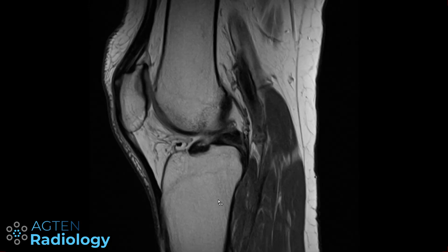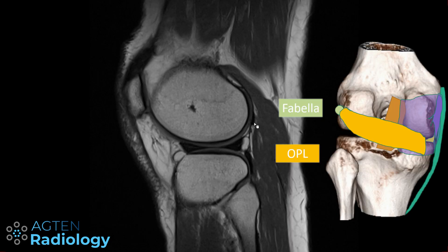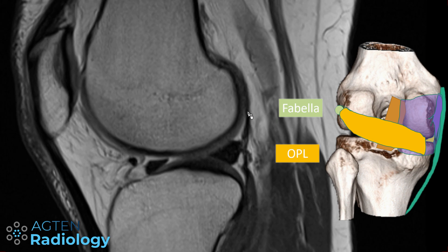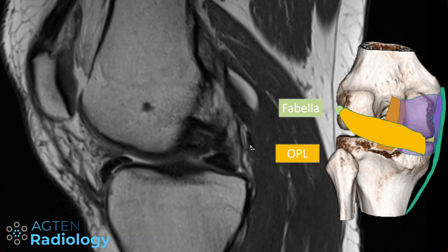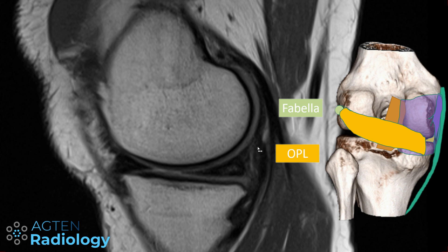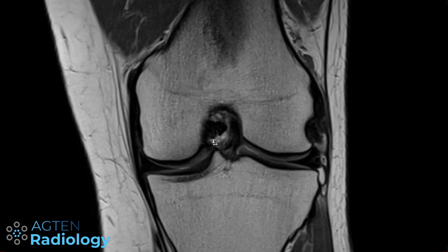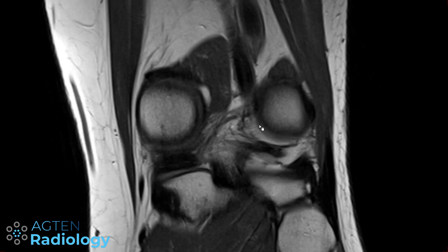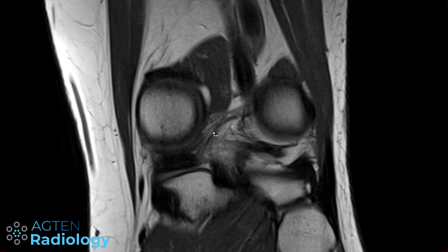The best way to identify the oblique popliteal ligament is to go to the lateral side of the knee. Here's the fibular head, then go to the region of the fabella, and if you scroll medially from there you will see the posterior joint capsule, which is a little bit thickened at times. You can see band-like structures running obliquely a little bit downward, blending in with the joint capsule on the posteromedial side of the knee. This is basically your oblique popliteal ligament. Sometimes it's also shown on coronal views, but it's really hard to see, and sometimes you don't see it at all — I wouldn't bother too much with describing isolated injuries here.